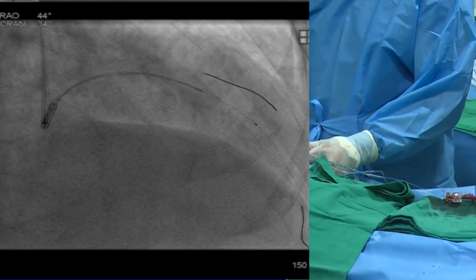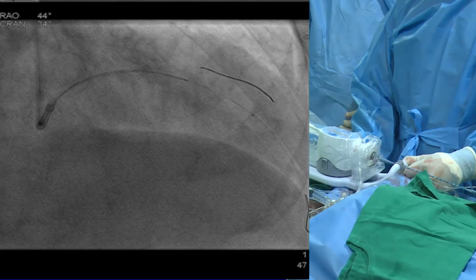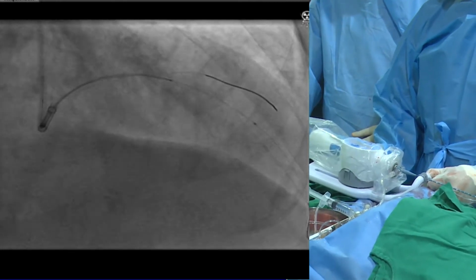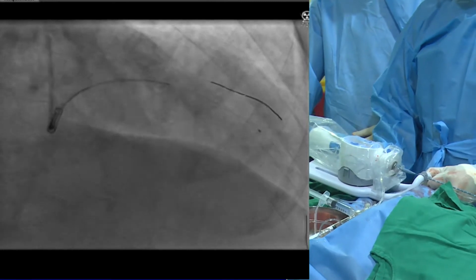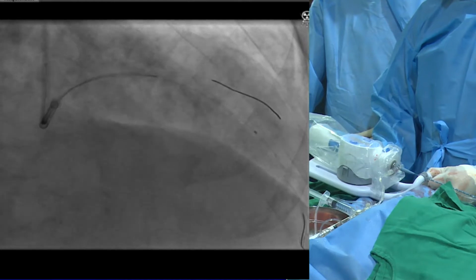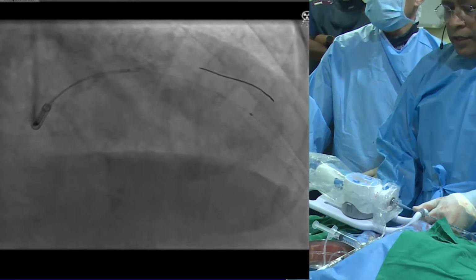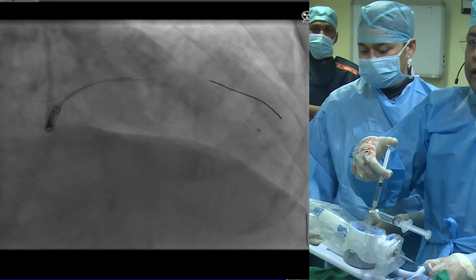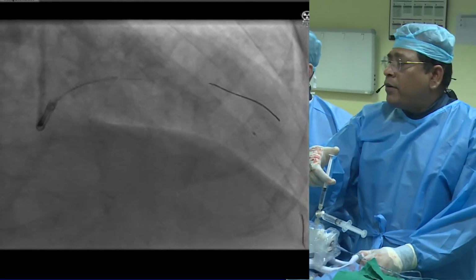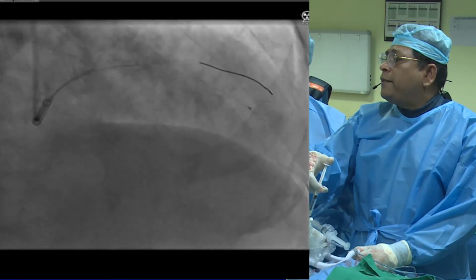So you see here the vessel size is not very great, and it is a diseased vessel. And the segment which we are feeling is okay, is also diseased. You see. And now we have to take a cine, where there is basically a disease landing zone. So we will take it again if needed. So we are near the disease segment, and you can appreciate there is a little calcium here, and this is the tightest part. And here the frame, everything gets static. It should not move because of the landmarks you are taking. So maybe proximal. This is a good landing zone. I am taking a scene, you see. Okay. This is again a branch here, and we are in the probably left main. There is a little disease there.